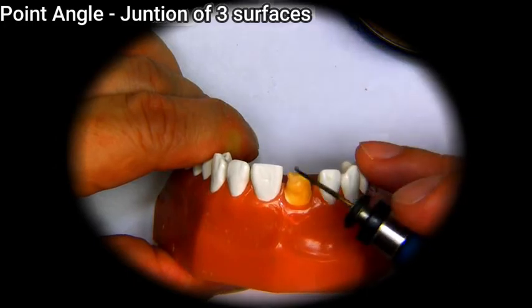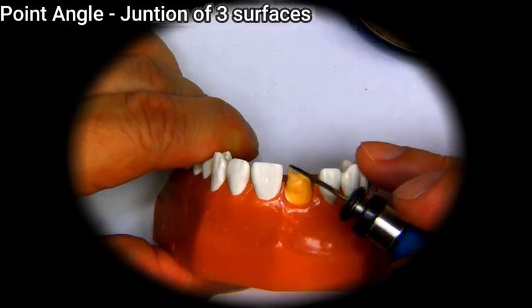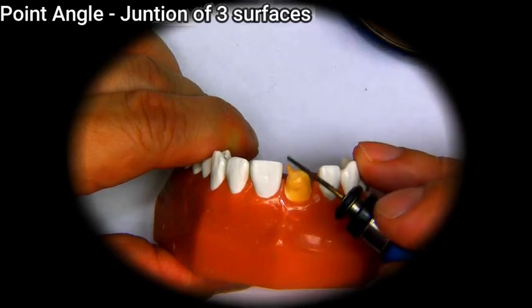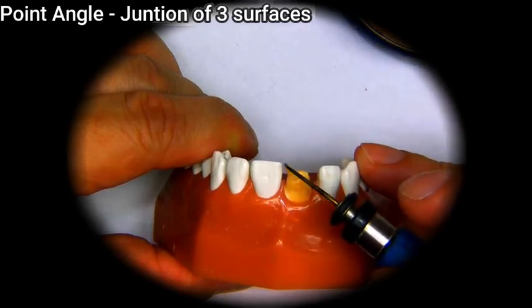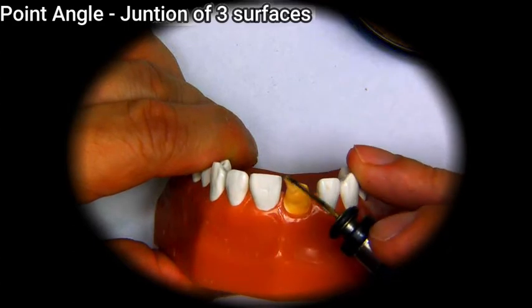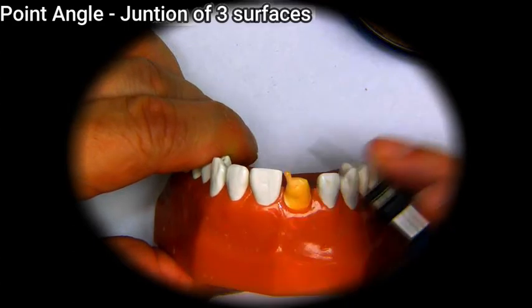So we will put a tiny bit of wax at a time until we reach that portion. You can blow on it to expedite the cooling of the wax if you like.